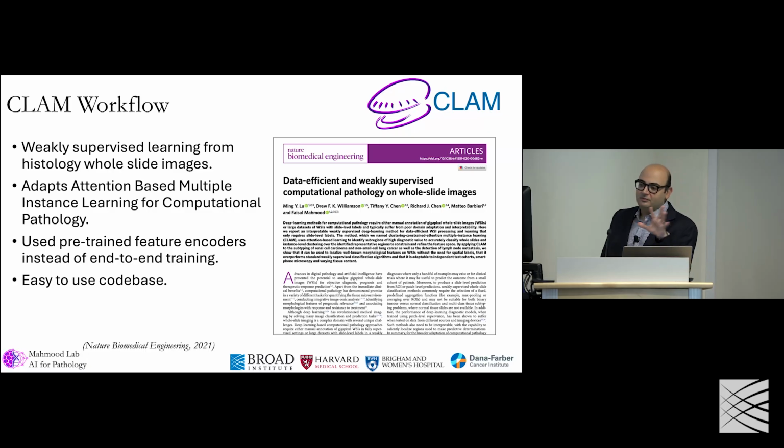And it used a number of different bells and whistles that were developed for computer vision. We brought them into pathology, and this included attention-based multiple instance learning, the utility of pre-trained encoders, and using clustering as a mechanism to cluster together similar morphologic regions within the slide. So a slide would have lots of normal regions, lots of disease-positive tumor regions. So clustering can potentially help associate similar regions together across entire cohorts.